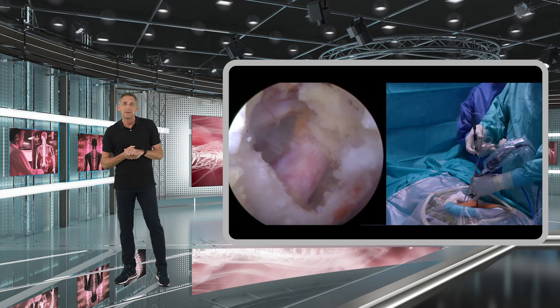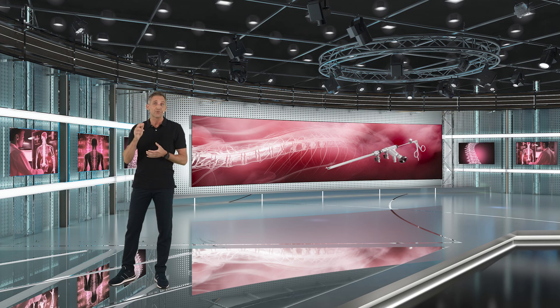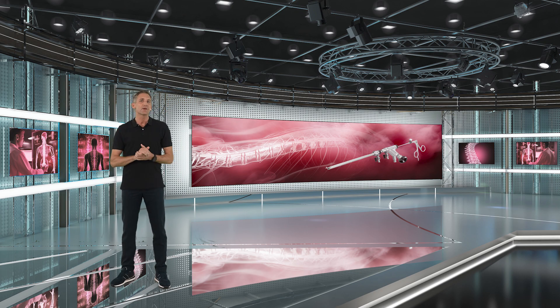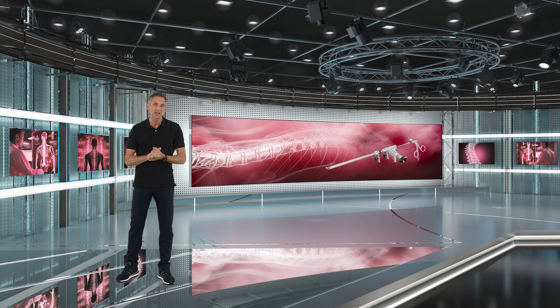Be aware that getting out a disc fragment through the axilla may be more challenging, and it is not necessarily recommended as a case for beginners — let's say when you're doing your first or maybe first ten cases.